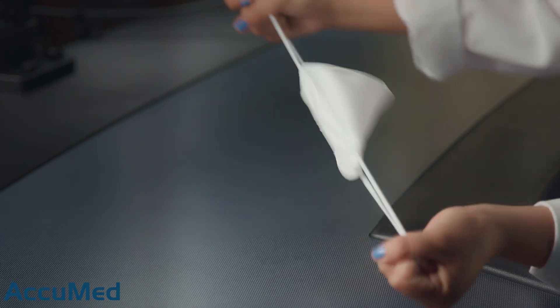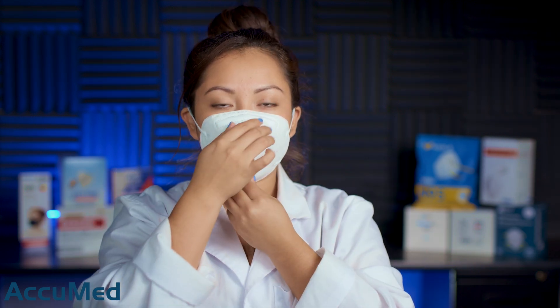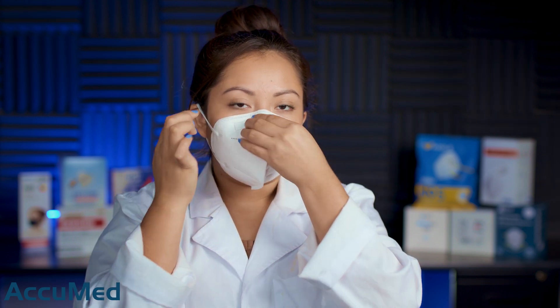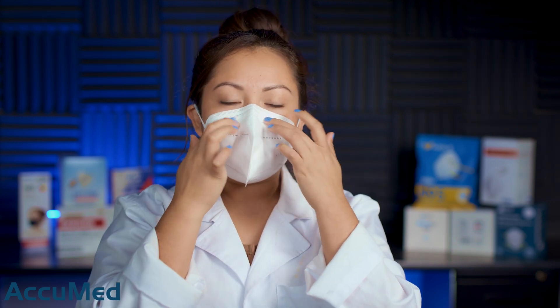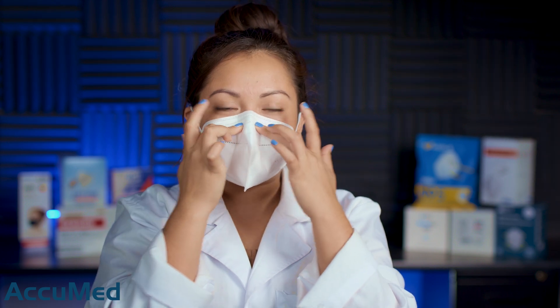And let's take a look at the straps. Let's go ahead and grab a new one. I'm going to flatten out the nose wire and try this on just for a quick reference to see how they fit on my face. The nose wire is not strong enough to actually hold its shape.